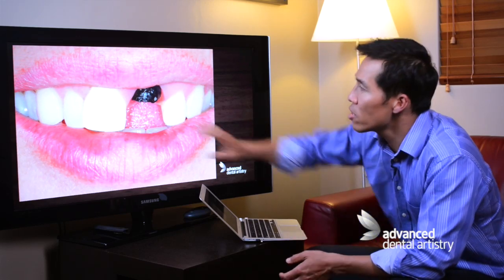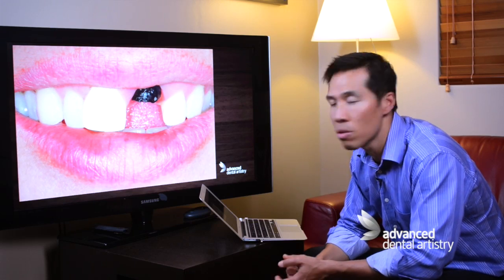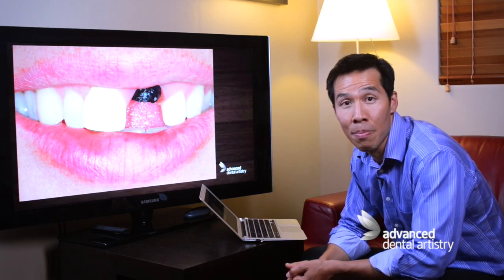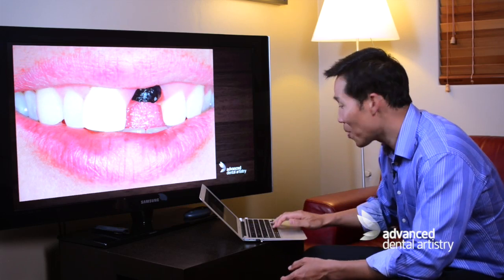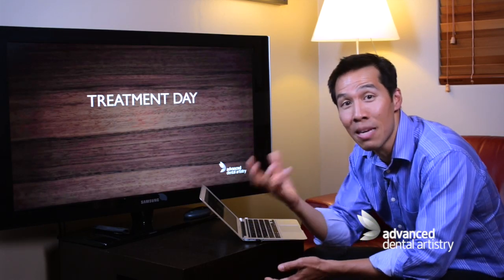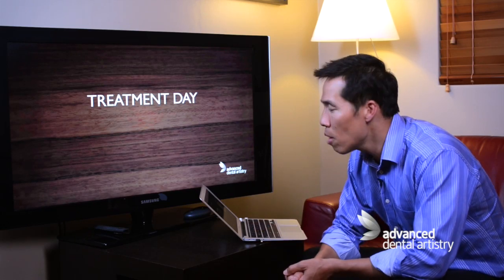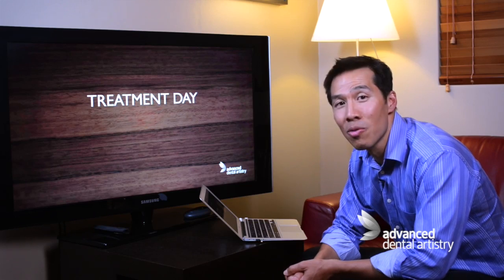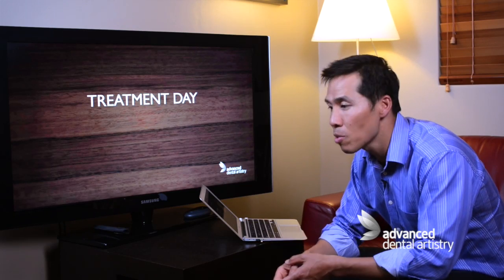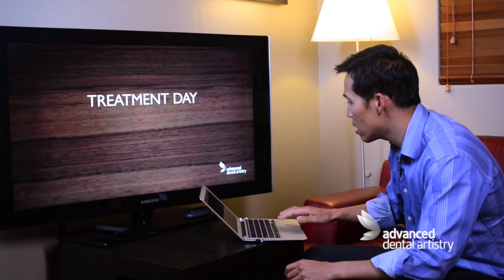She also mentioned that she didn't like the appearance of her other teeth, so we're going to do some porcelain veneers on the other teeth to get a better appearance and better cosmetics. I'm not going to show you photos of treatment day, because on treatment day we took that root out, placed the implant in at the same time, and placed a temporary bridge over the top. We know that implants take around 3 months to integrate into the body, so over that time the bone grows into the implant, and that then is fixed.